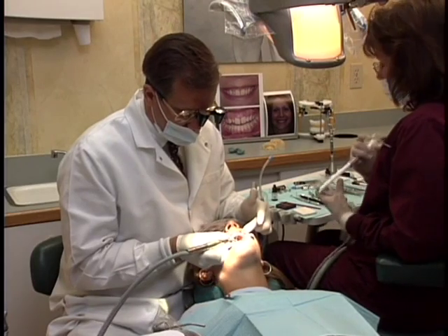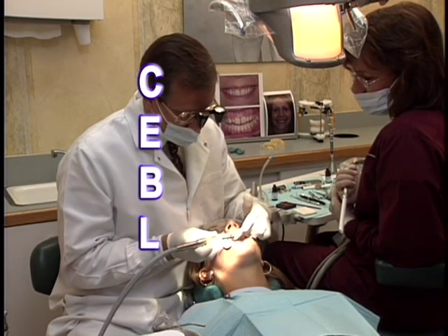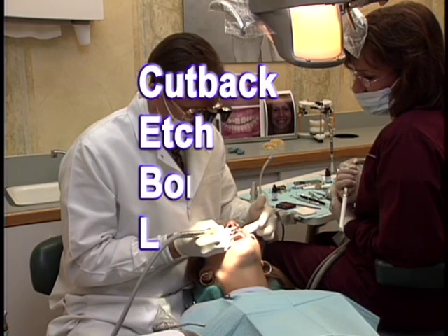From this point forward, the letters CEBL will best describe our steps. CEBL stands for Cutback, Etch, Bond, and Layer.